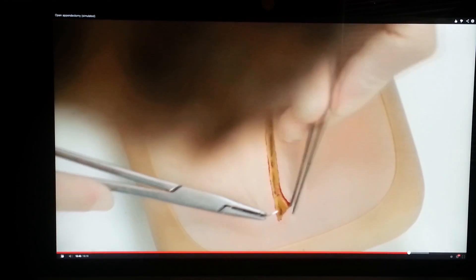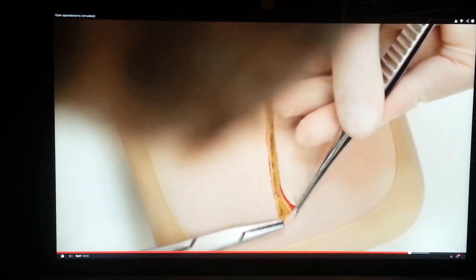A subcuticular suture of 3-0 Monocryl can be used to close the skin incision.